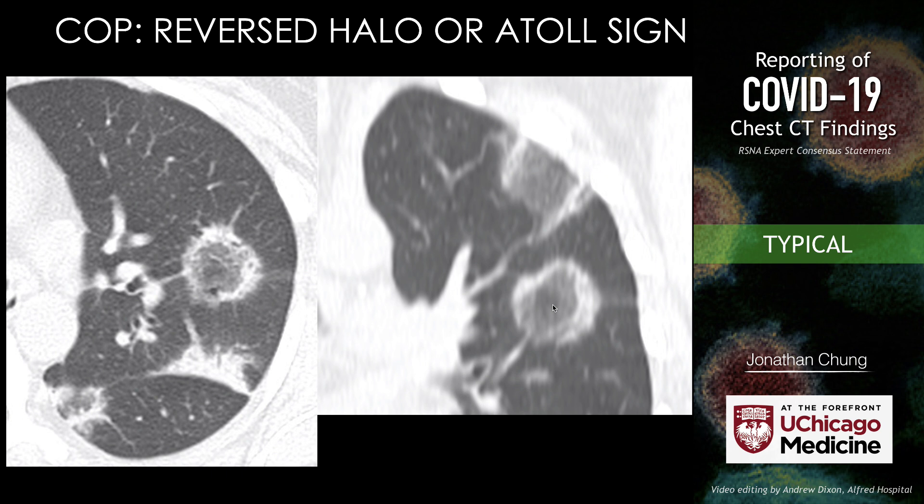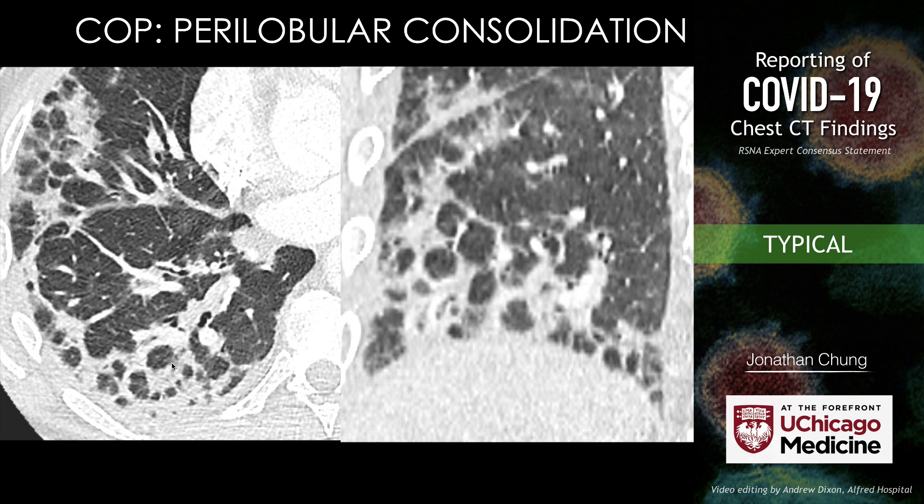This is a patient with reverse halo or atoll sign who has cryptogenic organized pneumonia — this patient did not have COVID-19, but I'm demonstrating the classic imaging appearance of the reverse halo or atoll sign. You have a surrounding rim of consolidation with central ground glass opacity. Oftentimes the rim is incomplete. Here's a less recognized pattern of organized pneumonia: the perilobular consolidation. Typically I see this perilobular consolidation at the lung bases in cases of organized pneumonia. It's been described in the literature but people don't talk about it much — and more often than not, it does turn out to be organized pneumonia.